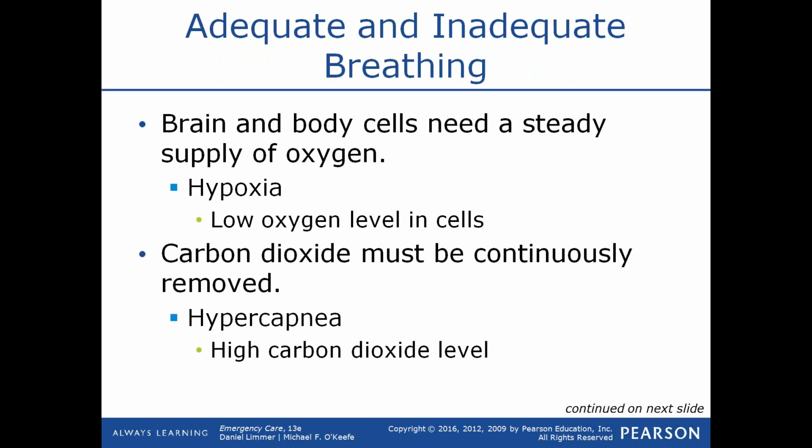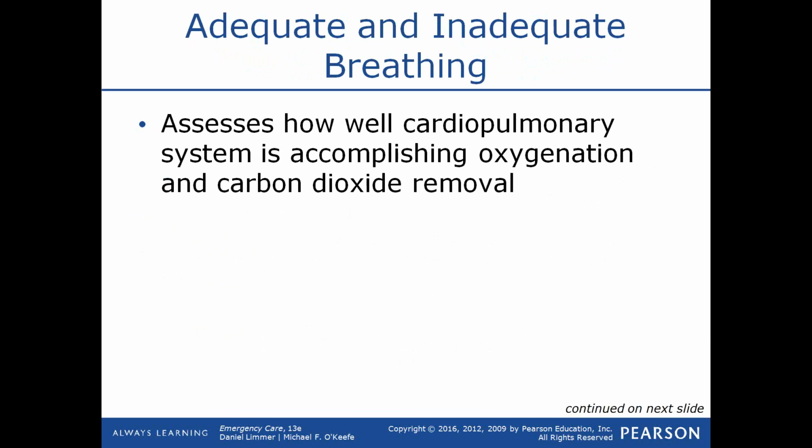And we'll learn that you can use, as an EMT, a pulse oximetry to measure oxygenation, and you can use an end-tidal CO2 monitor to measure ventilation, or to measure whether the carbon dioxide is at the right level.